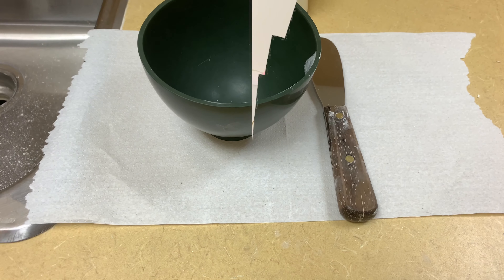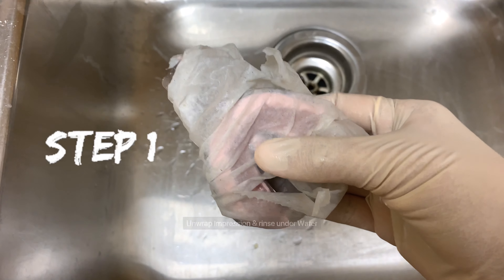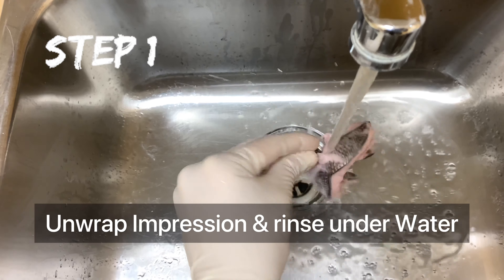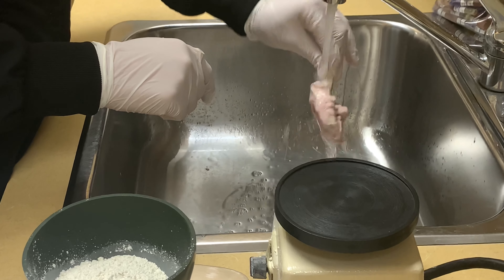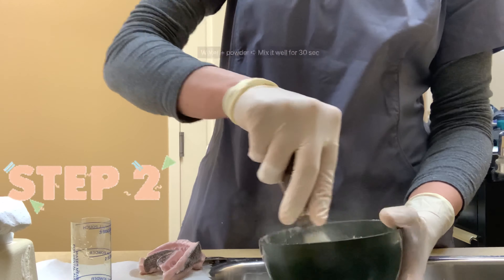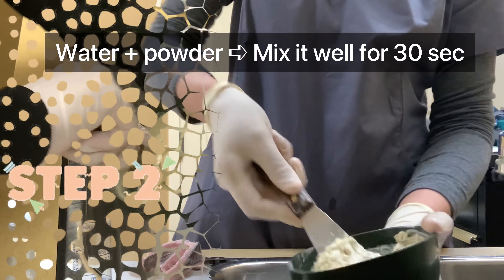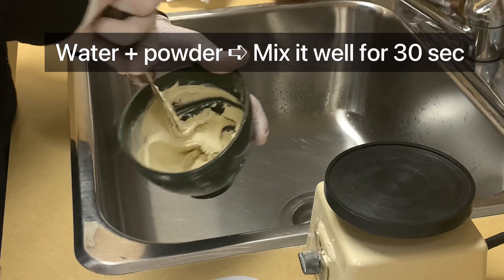I set up the bowl, spatula, and the vibrator. The first step is to unwrap the impression and rinse it under cold water. After that you can dry it, but avoid dehydrating the impression. Get an appropriate amount of water in a bowl, add the powder, and mix well — approximately 30 seconds. This helps to reduce air bubbles.